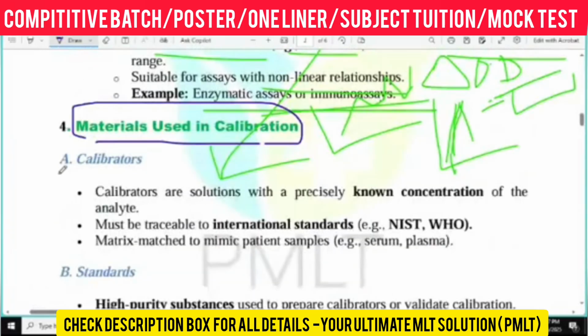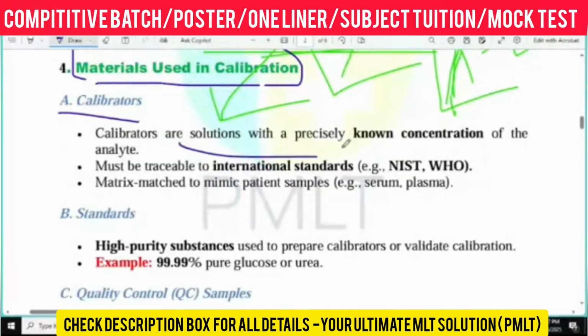See, a calibrator is basically a solution with a precisely known concentration. Getting my point? A calibrator you can easily purchase commercially as well. There should be a known concentration of the particular solution, and it must be traceable to the international standard. You have to match the calibrator to an international standard, such as NIST, the standard and international organization.